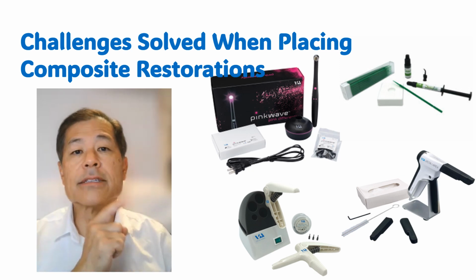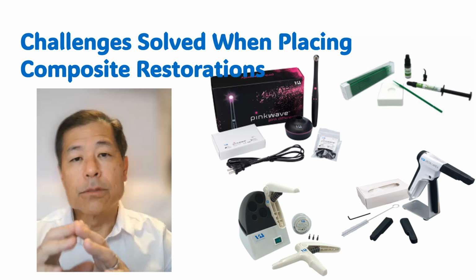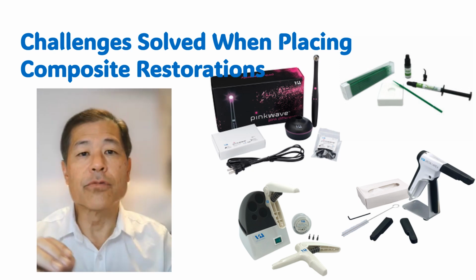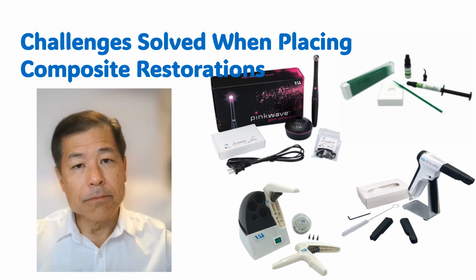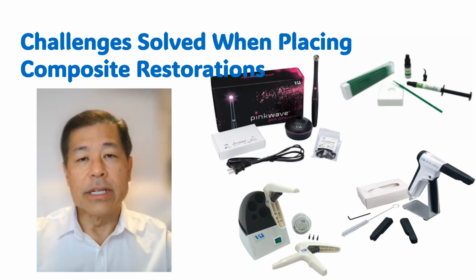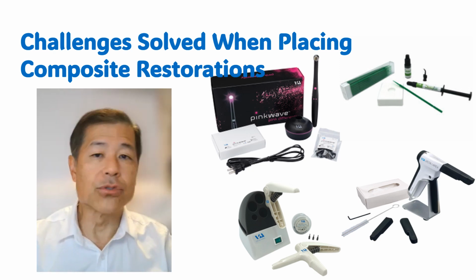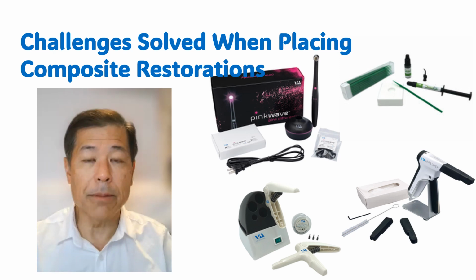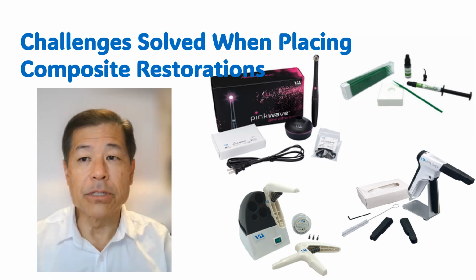What you see a little bit further up on this slide is the seam-free. Seam-free is a composite wetting resin. So that is what actually will help me spread that composite that I've warmed up and I've placed on the tooth. And now the seam-free will help me spread that composite, and it'll help me contour the composite. So I spread it, I contour it, but it will not add any film thickness because there is no filler in this. There's no additional photoinitiator and there's no additional solvent. So it will not affect the physical properties of my composite. It's just going to make the composite placement that much easier.